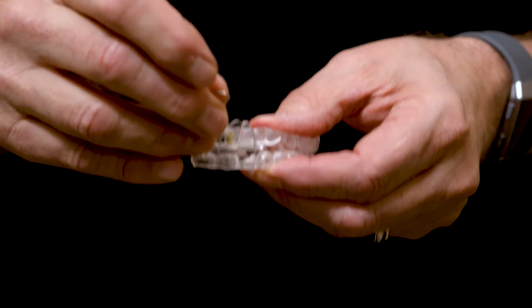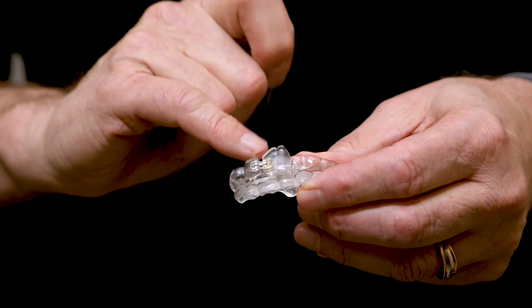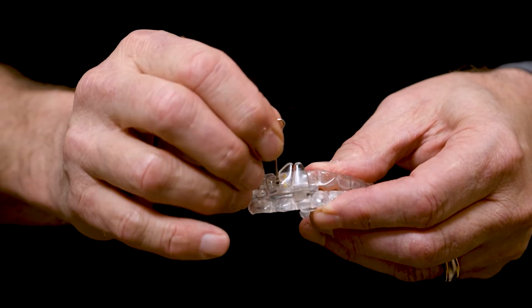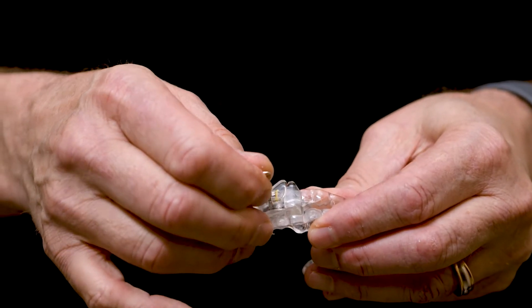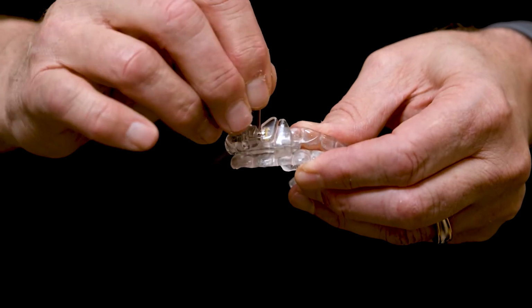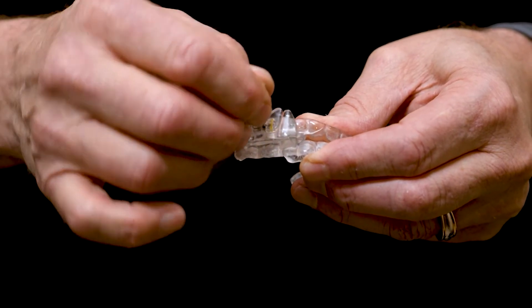And when we put a little device in the pinhole, we can turn this, and if you see the little arrow on the side, this arrow is pointing up. If we put this in there and we turn it a quarter turn, it actually is advancing the patient 1/10 of a millimeter. So each one of those turns, 1/4 turn like that, is advancing the patient 1/10 of a millimeter.